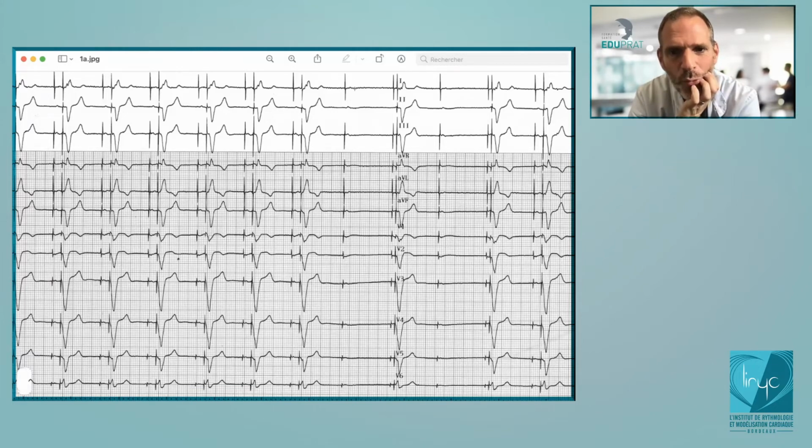So you see here, one blocked atrial activation, then you pace 80 milliseconds after the next atrial pacing. It is not enough to reverse and switch to DDD. But then the next one is also blocked. So if you count the P waves or the atrial activation, this one is blocked, this one is not blocked, this one is blocked. So it's 2 out of 4. So you repeat 80 milliseconds and you switch back to DDD. Okay, that was very simple. The functioning of the old MVP was very simple.